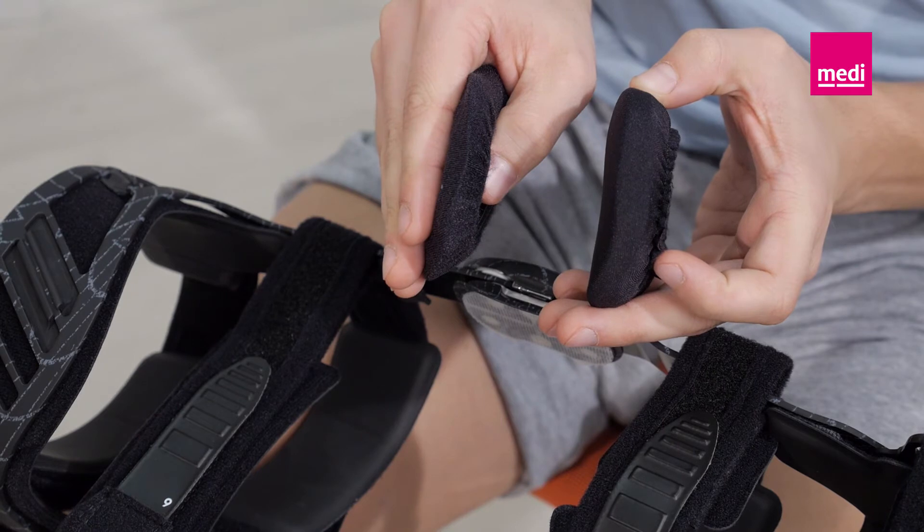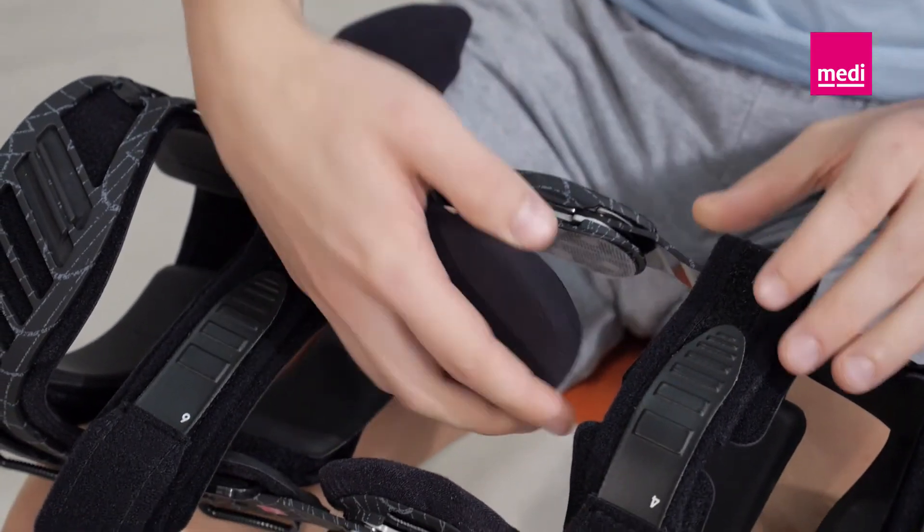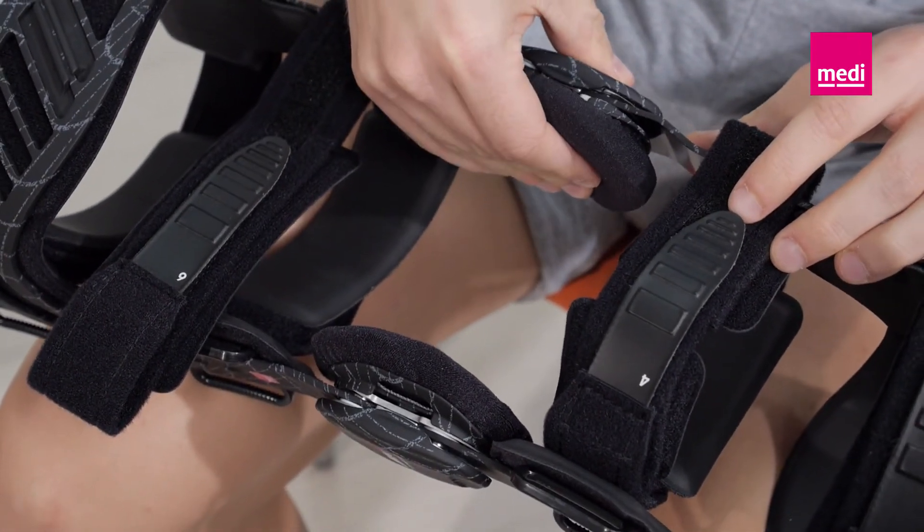Wear the orthosis directly next to the skin whenever possible. The inner pads and condyle pads can be washed by hand in cold water and a mild soap solution.